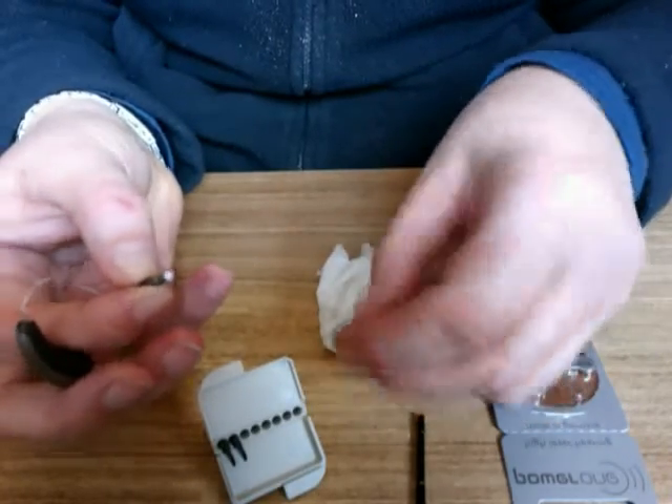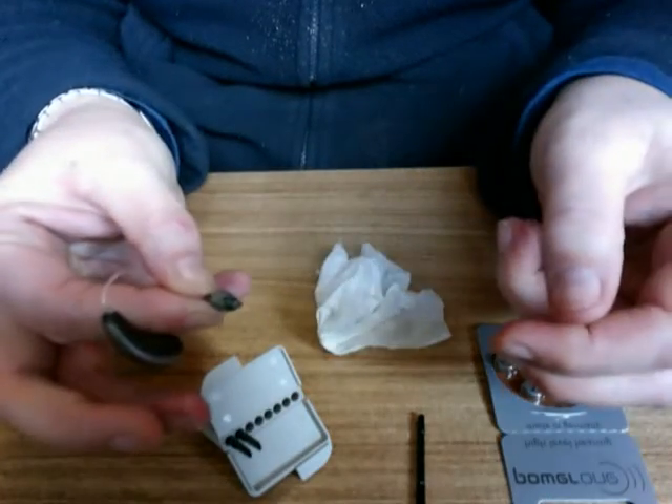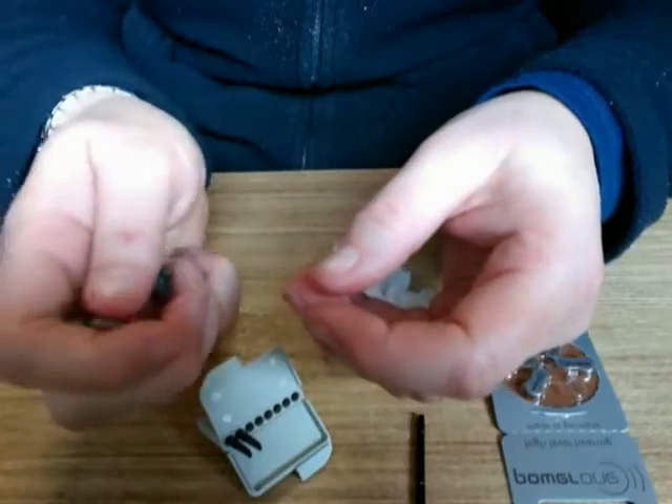Then we can replace the dome by giving it a nice firm push onto the aid, and then generally we'll hear the sound returning to the aid.